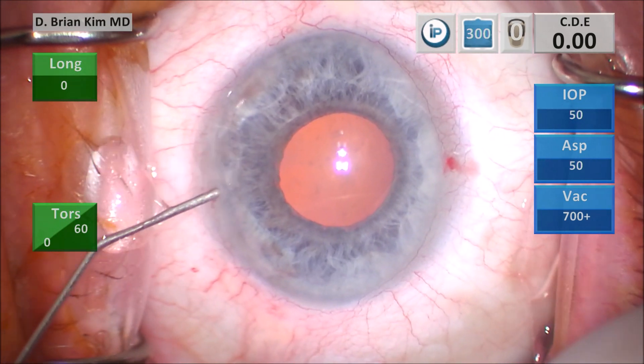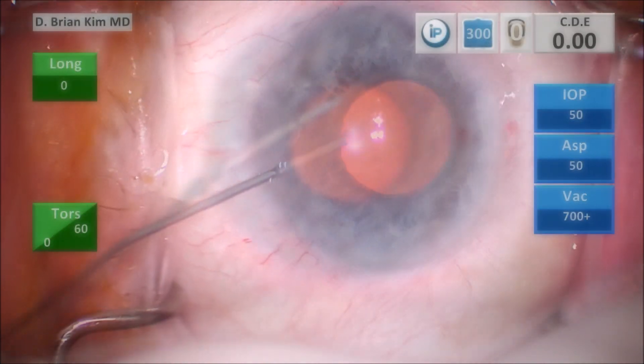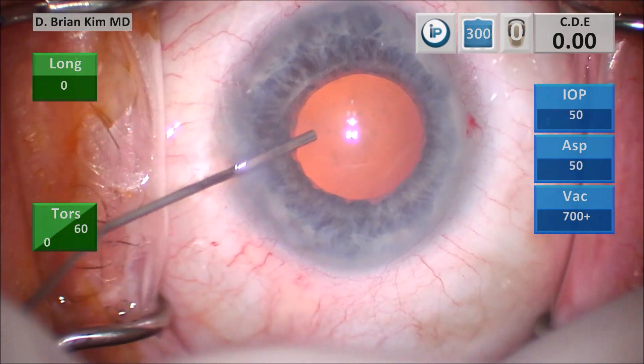I'm injecting some intracameral lidocaine and then intracameral epinephrine. The epinephrine did not help dilate the pupil. And then I injected some dispersive viscoelastic to open up the pupil.